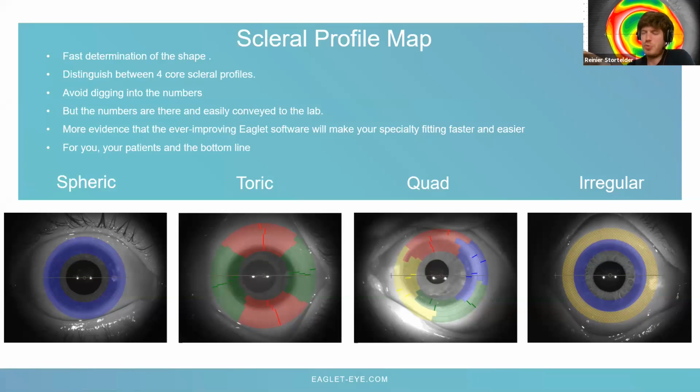We urge you to be careful. As mentioned in the beginning, we try to reduce and remove pingueculae, but if it's really large, it might be very hard to detect it. So it may come up with a false too flat prediction.